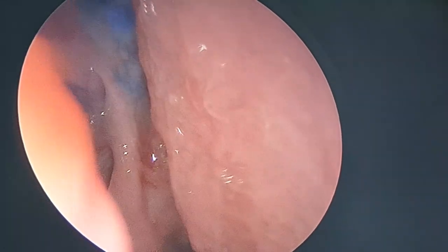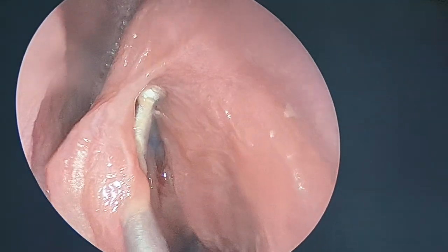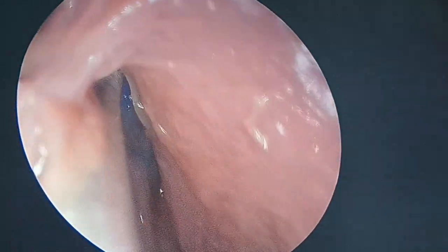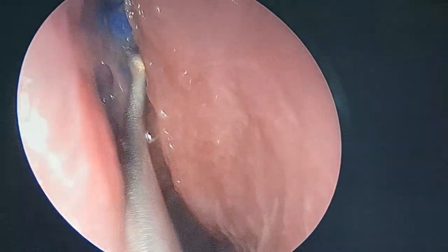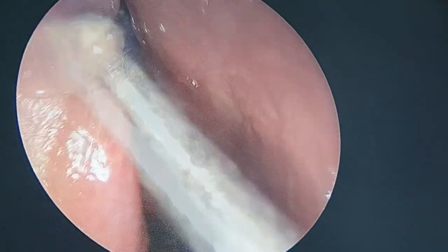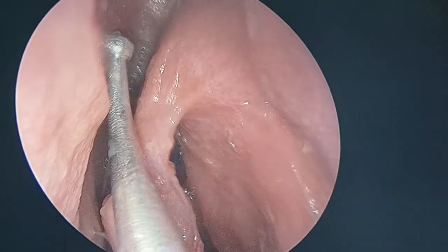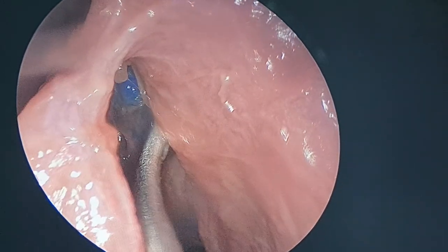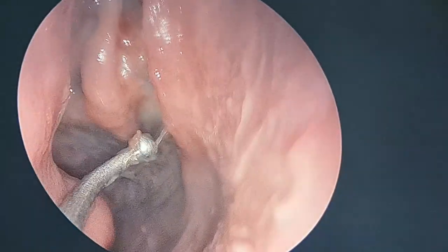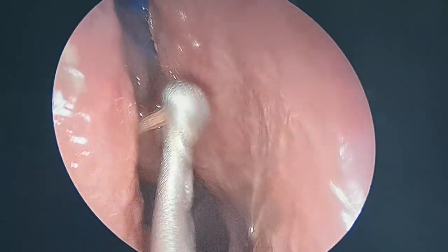Most often, fortunately, over 90% of the time, this upper part joins the lamina papyracea and turns medially, and that's how this gives the medial boundary for the frontal recess also. In an uncommon situation, particularly when the agger nasi is too pneumatized or the middle turbinate is abnormal in anatomy, this may go medially to insert either on the middle turbinate or even on the skull base. And in that situation, if you try to remove the uncinate, it can give you a skull base fracture and a CSF leak. Imagine, at the step of uncinectomy, if you develop a CSF leak, it is amazingly depressing to the surgeon. So you have to be very careful.